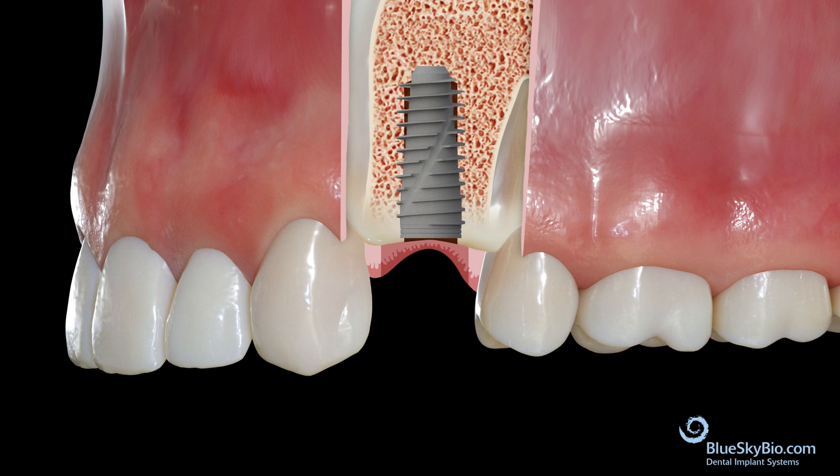Do not use with osseodensification burrs or other bone compression techniques, as these implants already compress bone. This can lead to over-stressing of bone blood supply and higher failure rates.